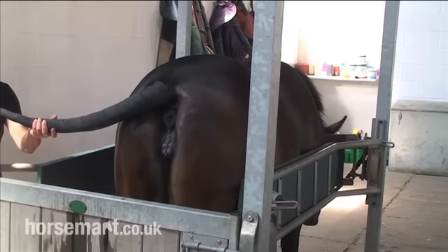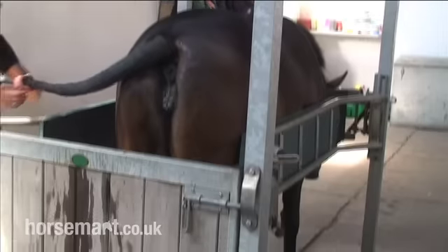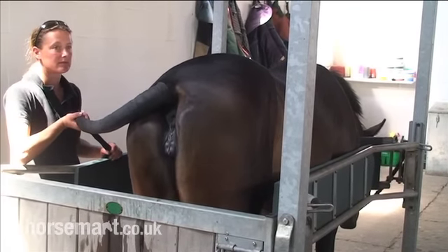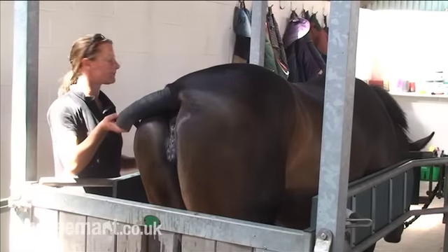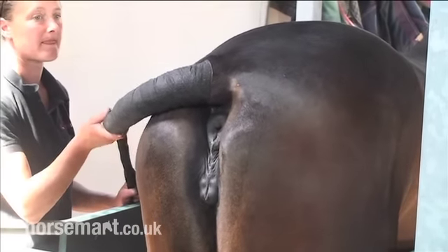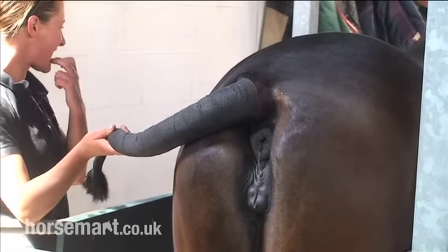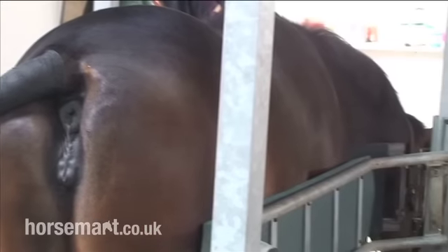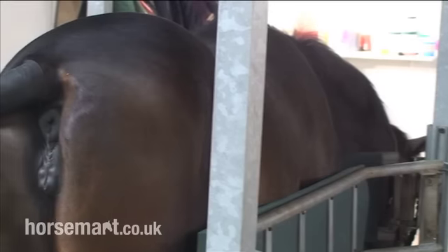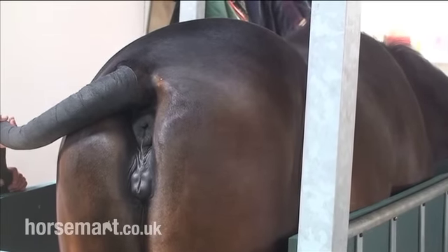This is Joss Mart of EquineReproduction.com. We're looking at a mare that's standing in the stocks, preparatory to having an embryo transfer flush performed. She's been prepped up — her vulval region has been washed, she's got a tail wrap on, and that tail is kept out of the way to avoid recontamination. She is tranquilized, which is why she's standing there with a droopy lower lip and her head right down. It's a good idea to tranquilize because she's going to be standing in these stocks for a while during the flush.